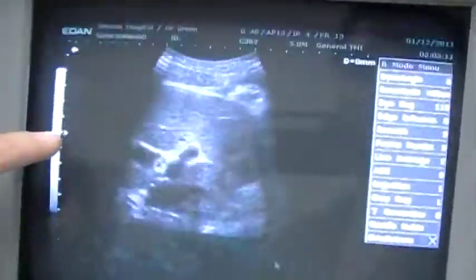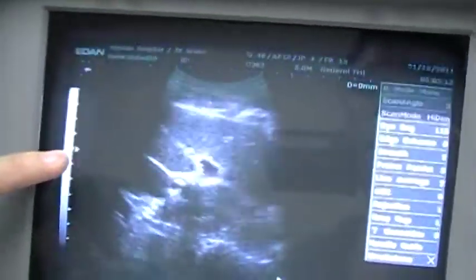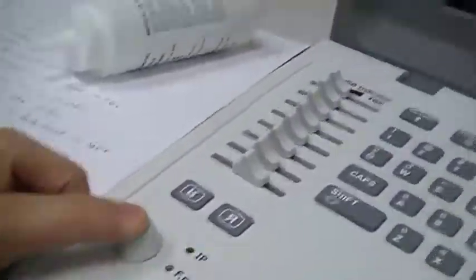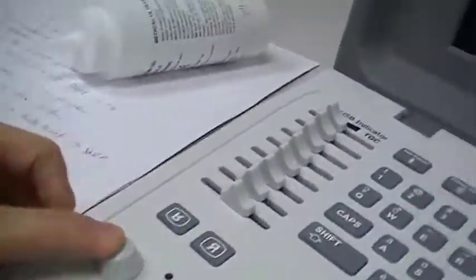Now we want to change the focus position and the number of focus points. Currently we can see there is only one focus. Press this key, then move the focus to the area you want — for example, move it here and press to confirm. The focus area is now set to that position.